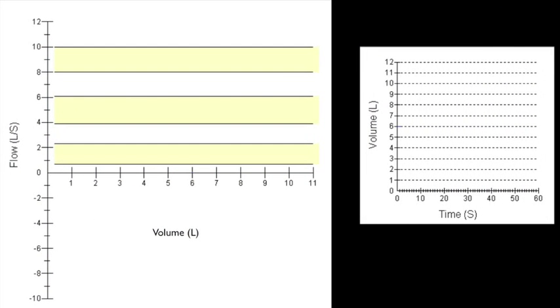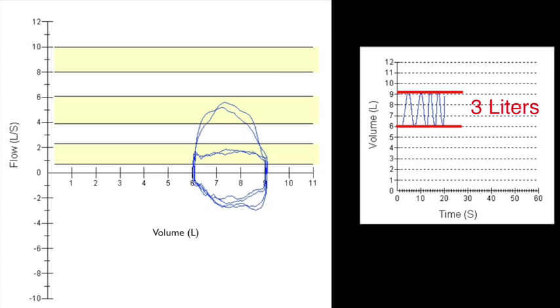You are now looking at an example of a flow volume verification screen. On the left you see a graph tracking flow rate in liters per second on the y-axis and liters on the x-axis. The right-hand graph shows volume on the y-axis across time on the x-axis. In this example, expiratory syringe strokes of 3 liters at 3 different flow rates are being graphed. Notice how the volume is always 3 liters regardless of the flow rate.